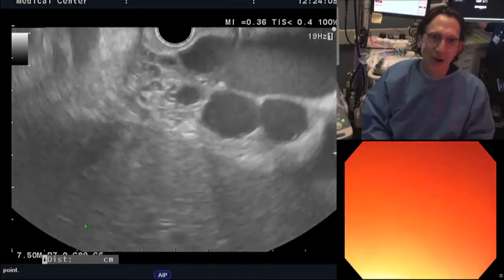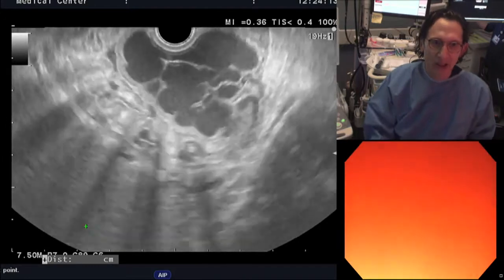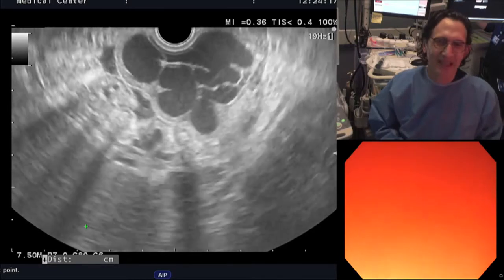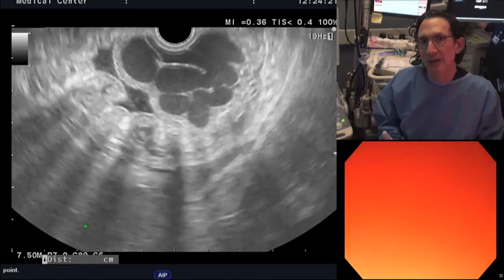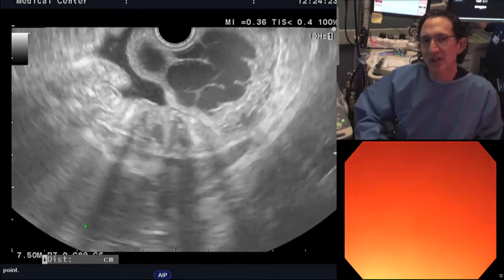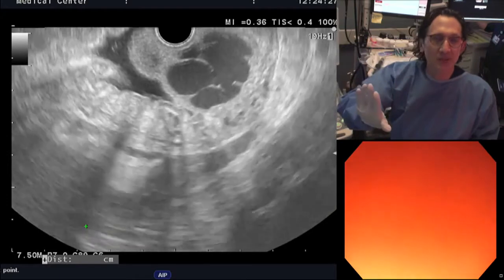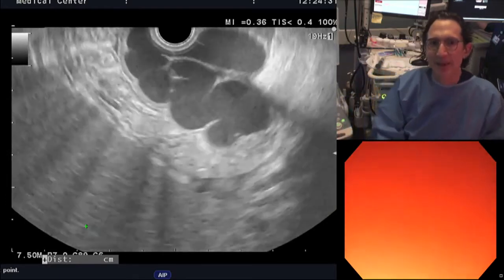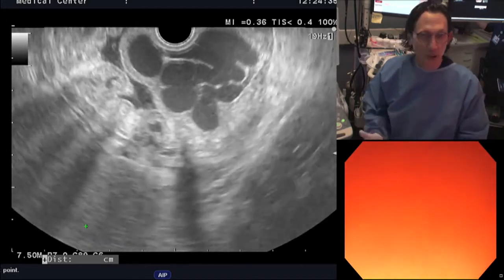All right, so now we come back to these guys, and I can treat these, but I'm going to be doing it transcardia. It's not transesophageal. It's not really transgastric either, because I'm still high up there. I'm not coming in my normal retroflex position that we would use if we did this endoscopy guided. But it's not ideal, because I always prefer to go transesophageal, transcrural if I can.